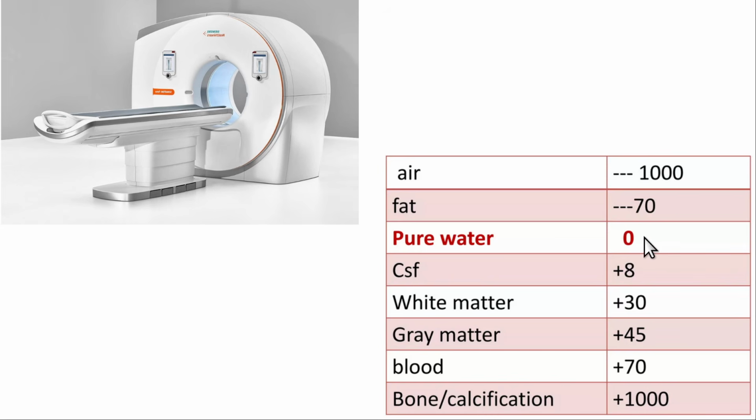Geoffrey Hounsfield, a guy from England, was one of the co-discoverers of the CAT scan. Actually, the Beatles helped provide the initial funding to make the CAT scanner, through EMI, Electrical Musical Instruments, and they helped fund it.